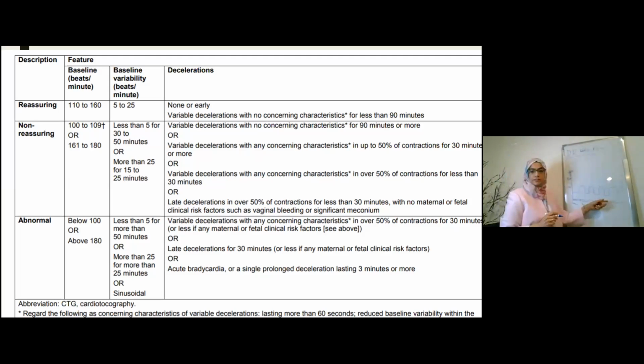So the mom is contracting. What happens when there is a contraction? As you know, the blood flow to the uterus is slightly decreased. That's why the Americans call labor a stress test, right? When you stress the baby with a contraction, but the baby is nice and healthy and can take a bit of a squeezing for it to come down, you will see that there are no problems with the CTG, okay? So even when the mother is having a contraction, there are good accelerations along with the CTG. So baby is not upset, okay?